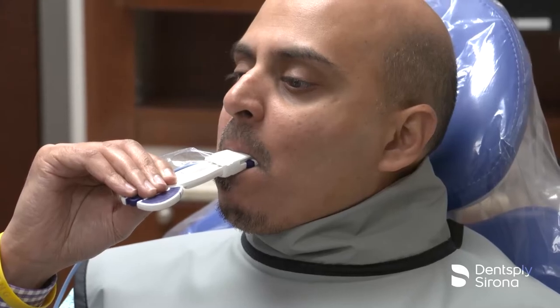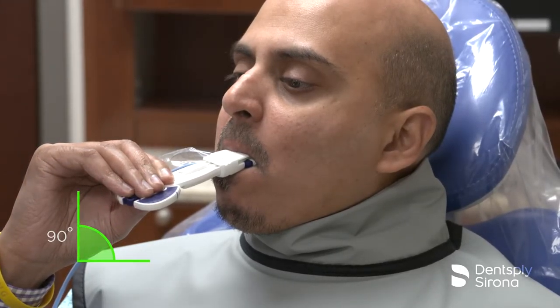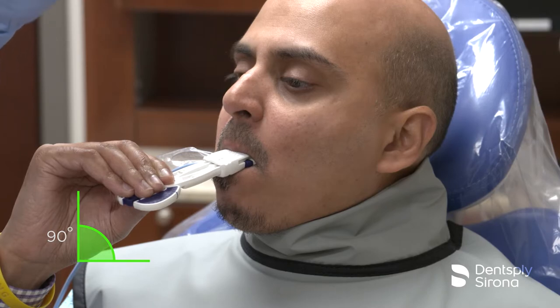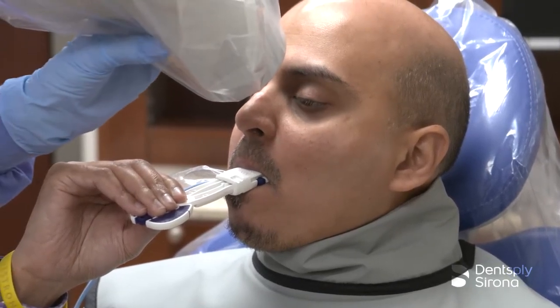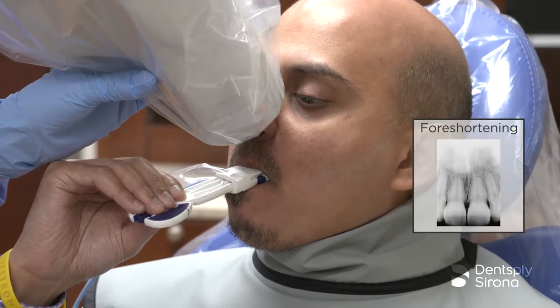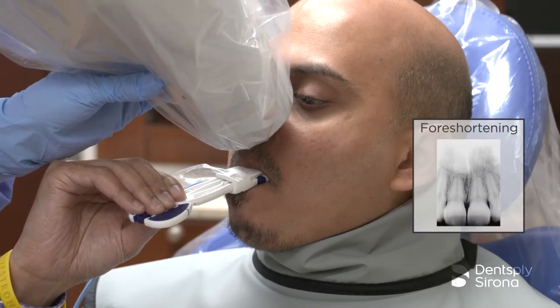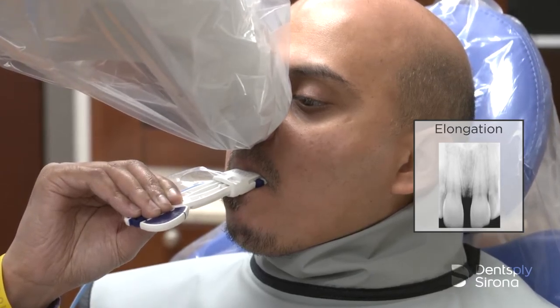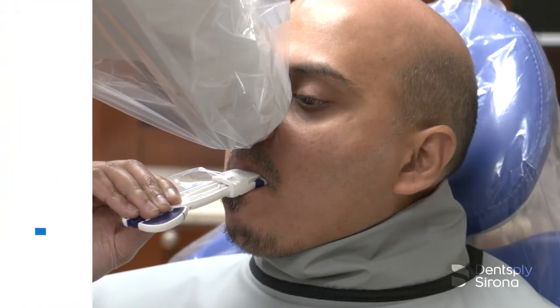The vertical angle must be directed at 90 degrees to the imaginary bisecting line. Too much vertical angulation will produce images that are too short or foreshortened, and too little vertical angulation will result in images that are too long or elongated. The beam must be centered to prevent cone cutting.